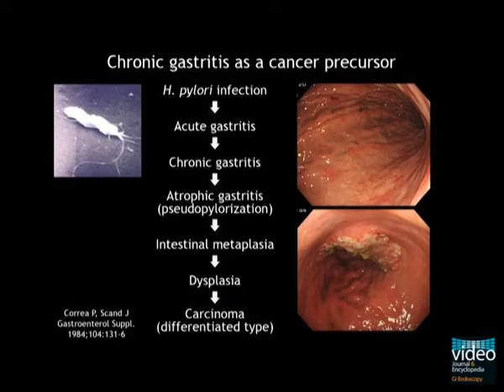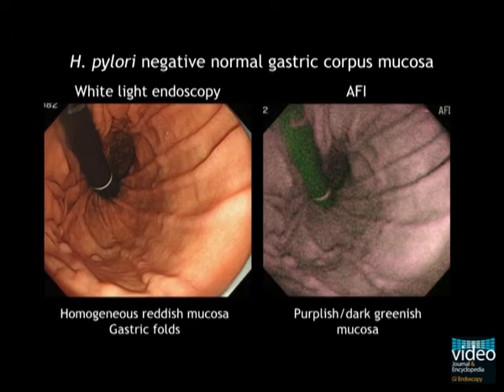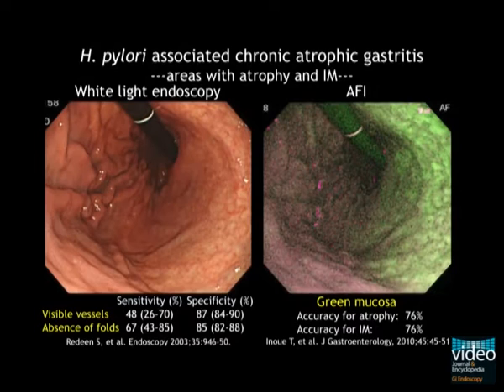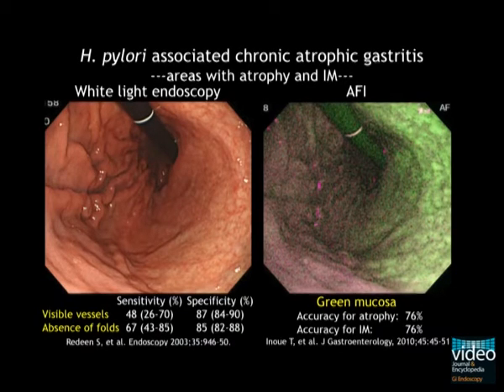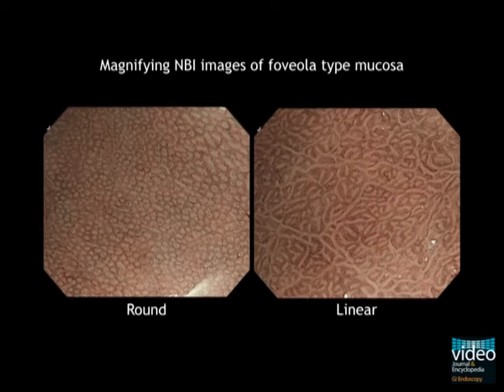Longstanding inflammation associated with H. pylori infection causes atrophy and intestinal metaplasia in the gastric mucosa. In the corpus, H. pylori negative mucosa has gastric folds in the white light image and a purplish colour in the AFI image. While in patients with chronic atrophic gastritis, mucosa with atrophy or intestinal metaplasia looks whitish, increases visibility of mucosal vessels and loses gastric folds in the white light image. In the AFI image, the areas with atrophy or intestinal metaplasia look bright greenish. In the magnifying NBI image, mucosa with inflammation have round pits, while mucosa with atrophy or intestinal metaplasia have linear gastric pits that are surrounded with brownish capillaries.